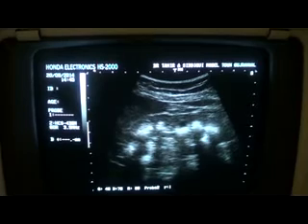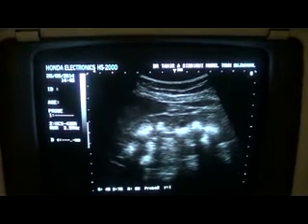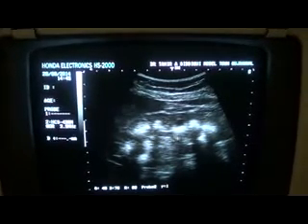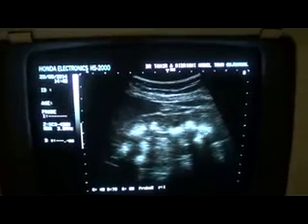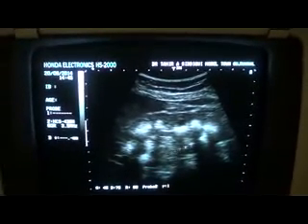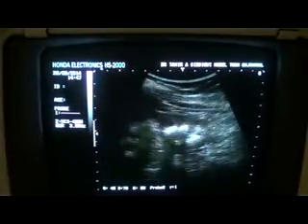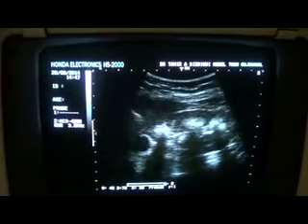You can see there is no central sinus echocomplex, no hydronephrosis. You can see dense, coarse, echogenic areas, globular, and this is the other one throughout the anterior medullary region as well as the posterior medullary region, which is consistent with medullary calcinosis. There are a few cysts also seen in this case.